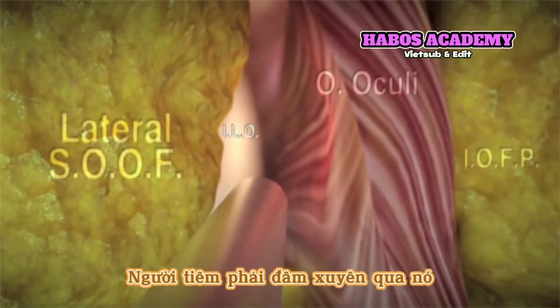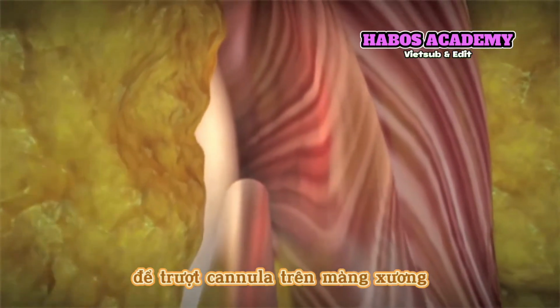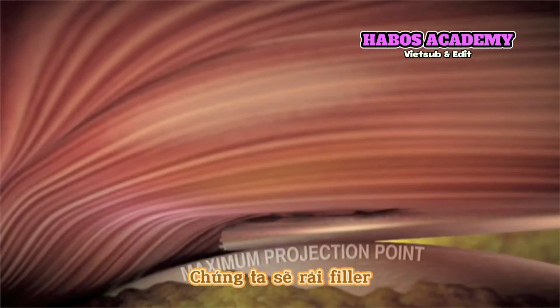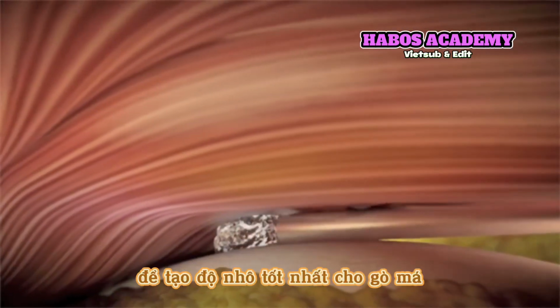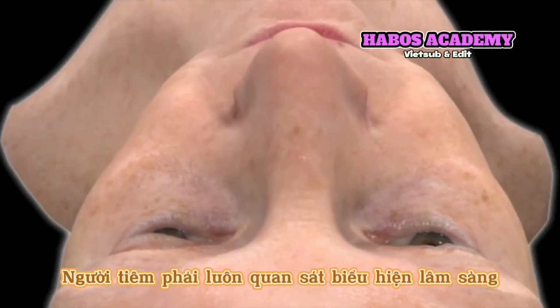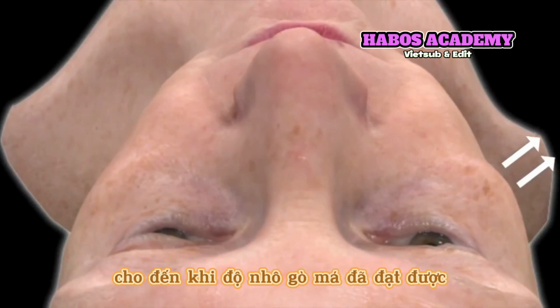The injector will proceed through the capsule, passing the cannula over granular periosteum, where the texture of the bone will be felt by the injector. Once in position, a bolus is placed at the desired area of maximum cheek projection. The injector will watch for a topographic tenting effect on the skin until appropriate malar projection is achieved.